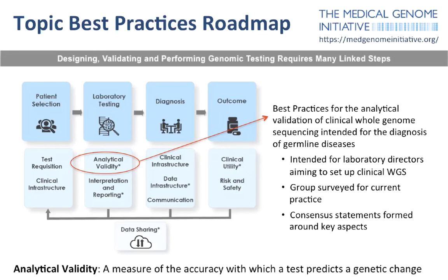We surveyed the group for current practice, and then we tried to define some consensus statements that were specific to genome sequencing around a lot of the key aspects in the validation.